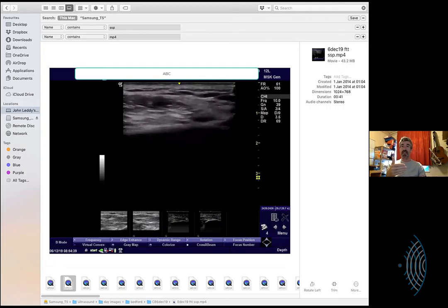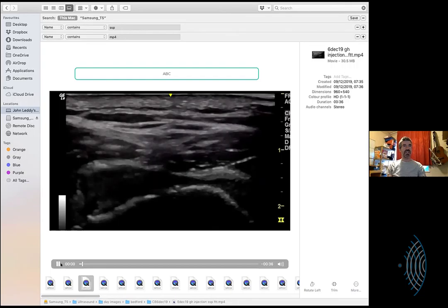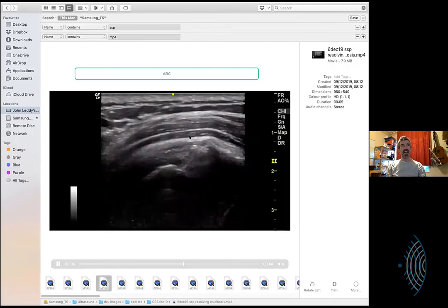The thing to know is that the one time the bone isn't 1 pixel wide is when you're going through in short axis, through the insertion of supraspinatus. You know, where the bone rises up. Then you do get a thicker bone because you are taking an angled slice, even though you're looking at the direction of the fibers. That's because there the fibers are not in the plane.